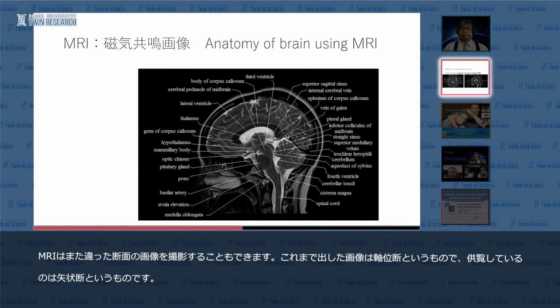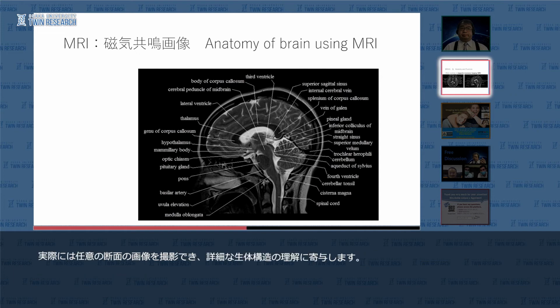The previously shown MR images are all axial images. Meanwhile, MRI can also obtain sagittal or coronal images and even oblique images as you want to see. Different views of MR images, such as sagittal images, can provide different types of anatomical information.